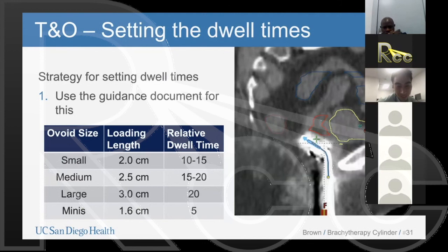Just to add one quick comment there, what Derek just said, I totally agree with him. I think traditionally and historically, the dose to point B was meant to be limited to 25% of the prescribed dose to point A. And if you have a straight symmetric implant, that's not a problem at all. If, say, the uterus curves over to one side, either left or right, and you have a pretty skewed implant, because point A stays with your applicator, but point B is anatomy based, then you may have the right pelvic sidewall point B being closer to the applicator and getting a higher dose compared to the other side, the contralateral side, the left. But I don't think anybody really pays attention to that anymore because we have 3D conformal and IMRT capabilities, generally speaking, that really helps us sculpt the dose and not overdose the pelvis from external beam. Yeah, I agree with that.